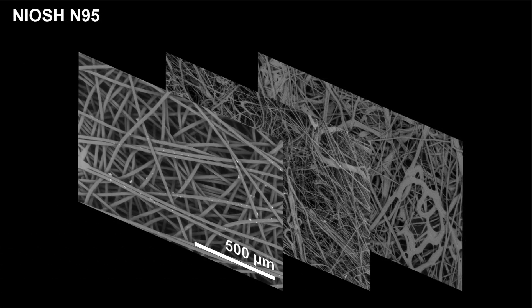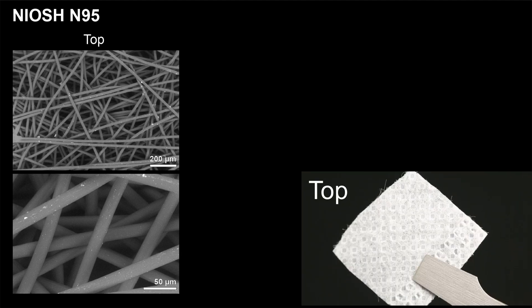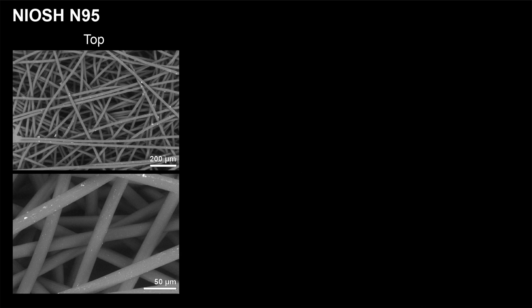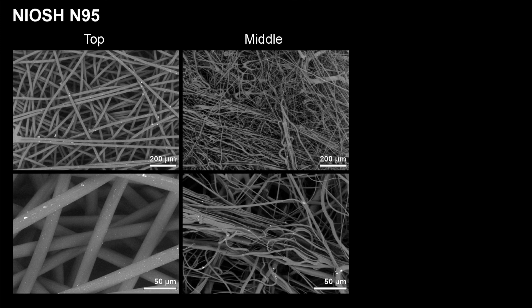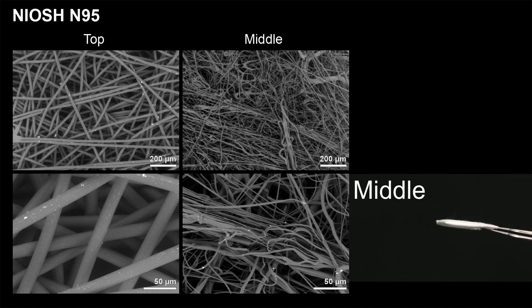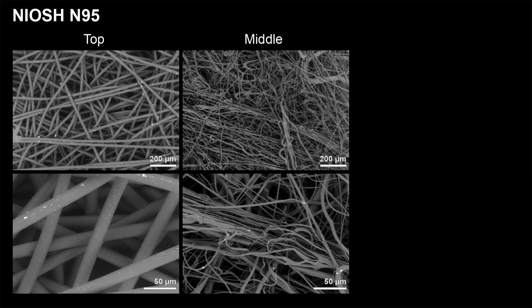N95 respirators are made of 3 layers, similar to level 1 and level 3 masks. The average diameter of the fiber in the top layer is 18 microns; however, the fiber density here is much higher. As with all masks, the most important layer is the middle layer. For the N95, the middle layer is very thick and is composed of very thin fibers with diameter less than 1 micron, as well as some thicker ones. The diameter of the thin fibers is quite similar to the ones on the level 1. However, when looking at the high magnification image, it is clear that the thin fibers are much more densely packed in the middle layer of the N95 than the level 1 mask — the spacing between the fibers is much tighter.